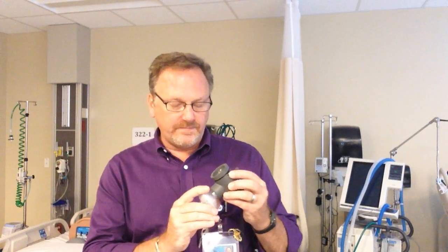You can use it to measure minute ventilation. Basically, you measure how much the patient breathes in 1 minute. You can also do tidal volumes and slow vital capacities. I'm going to step up so you can actually see the vane moving.